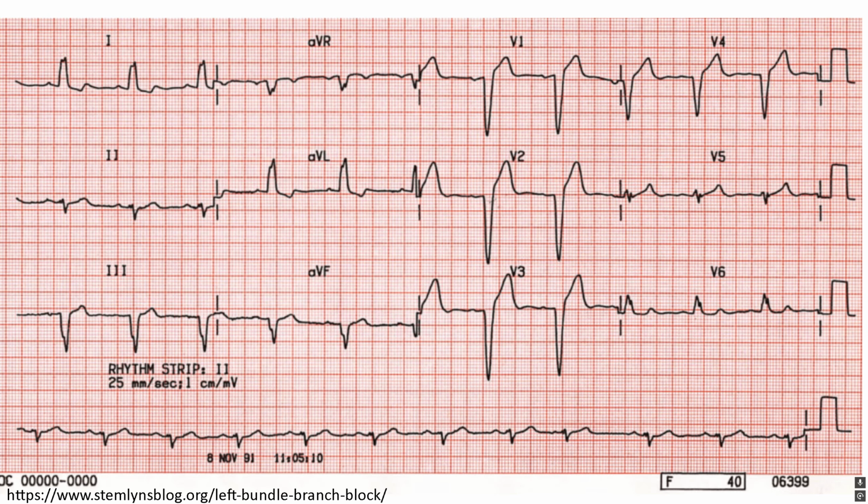Next, for the intervals, here's an example of a wide QRS. As you can see, the QRS in the precordial leads is bigger than 3 boxes. It's greater than 120, okay? So when you see a QRS greater than 120 with a P wave and no pacer spikes, the diagnosis is a bundle branch block. There's a bunch of criteria for bundle branch block, but there are simple rules to use.